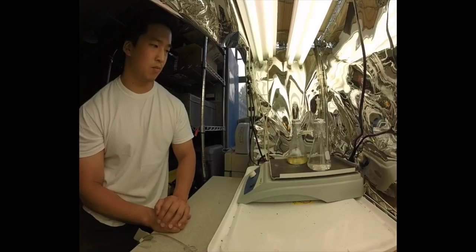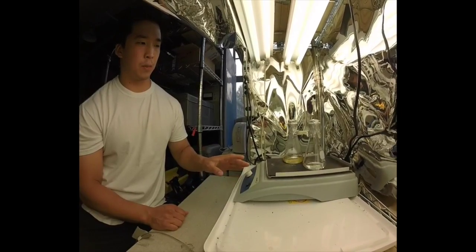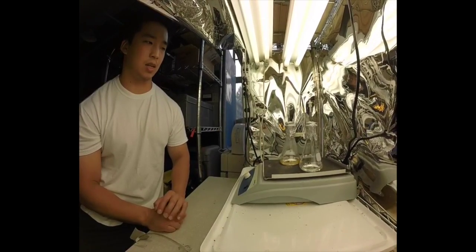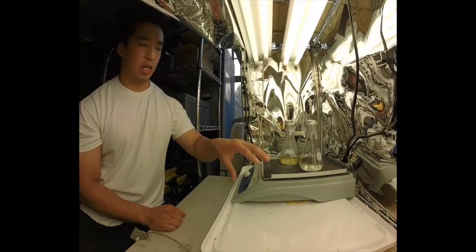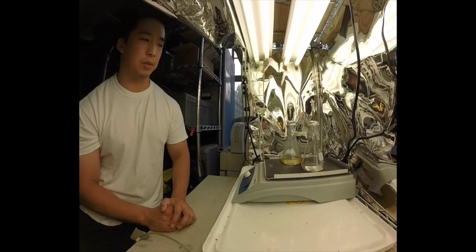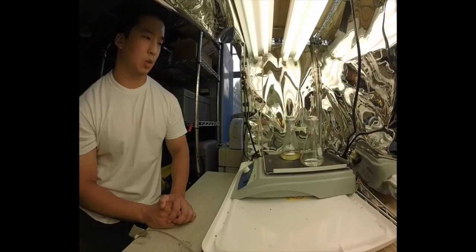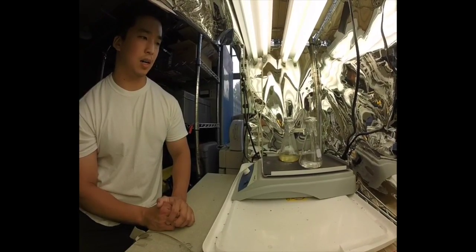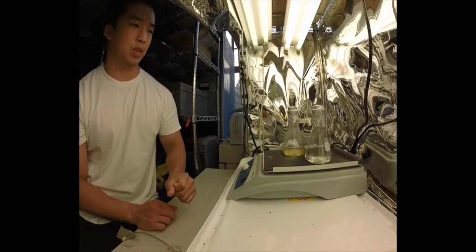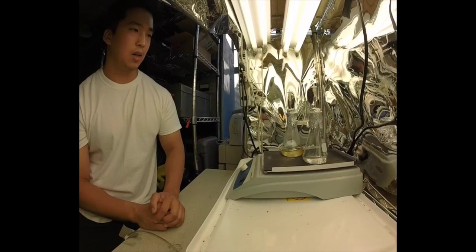Regarding the subculturing mentioned earlier, as I said, one way to do that is to remove the media and the roots and replace that. The other way, which might be easier, is to just get a new set of flasks and then transfer the algae into one side and then just place fresh B5 and a new set of roots into the other. And that generally works pretty well. And just once again, the roots, if they start turning a little bit darker brown or blackish and the media starts turning a little dark, then that's definitely time to do a subculture or another inoculation. We can let these go and they should grow up pretty quickly.